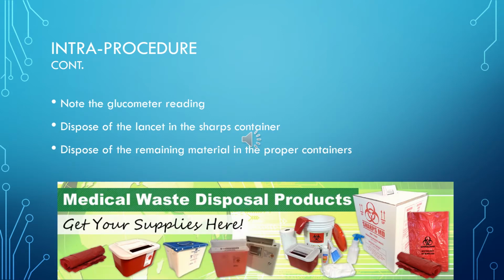After you've inserted the test strip into the glucometer, wait the required amount of time for the reading. Normally it does not take long at all. And then dispose of the lancet in the sharps container and then dispose of the remaining material in the proper containers in your facility.